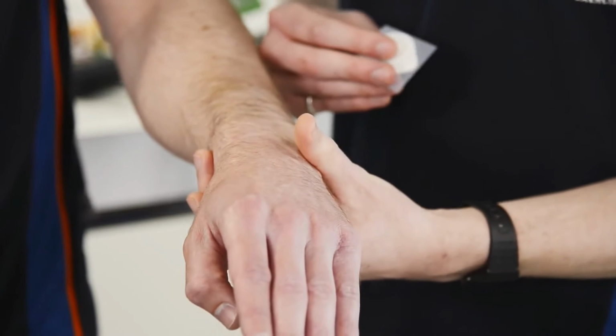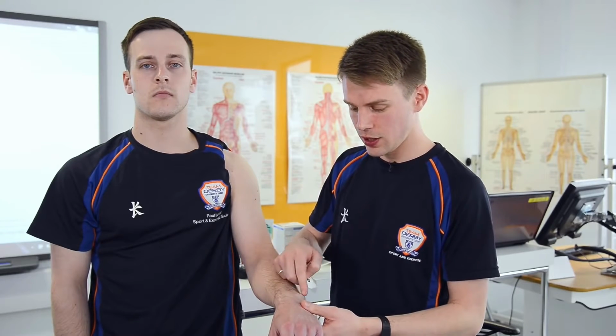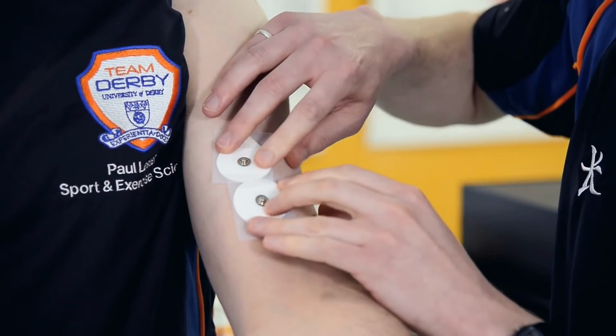As sport and exercise scientists, we may be interested in measuring this activity, and this can be done using a technique known as electromyography, or EMG. EMG can be recorded by inserting electrodes into the muscle, or alternatively, using electrodes placed on the surface of the skin which listen in. One is usually called the reference electrode. It's called this because the muscle activity is measured with reference to the activity here. Therefore, it doesn't want to be placed on a muscle, but over a bony landmark, such as the wrist. The other two electrodes are placed over the belly of the muscle, in line with the muscle fibre.